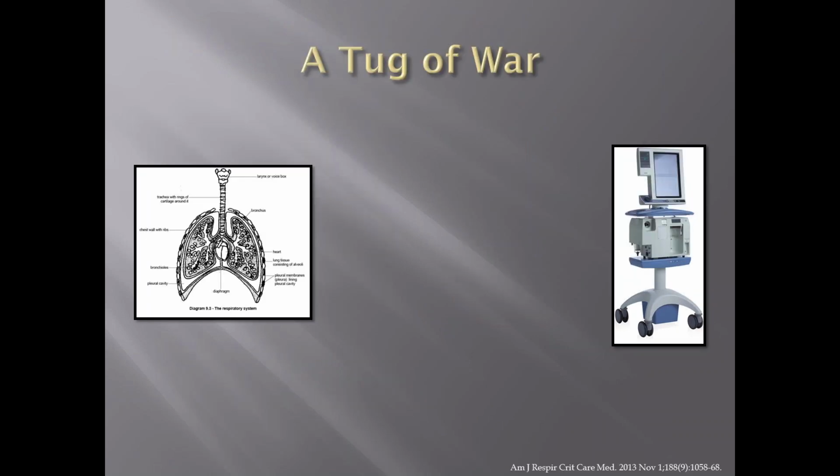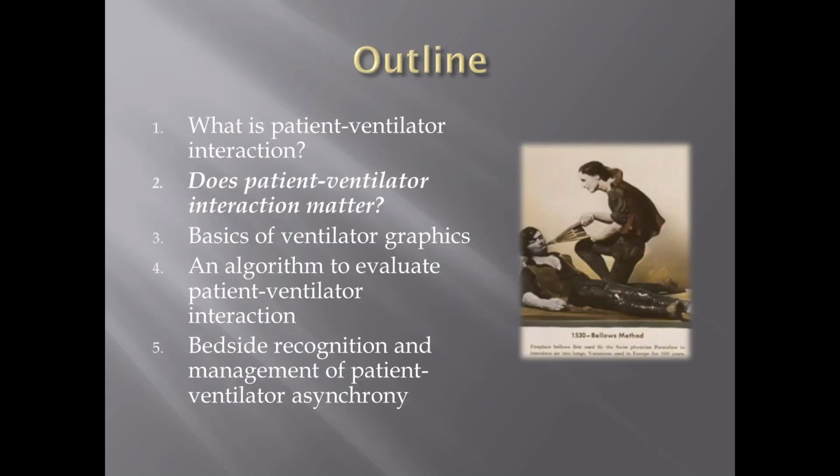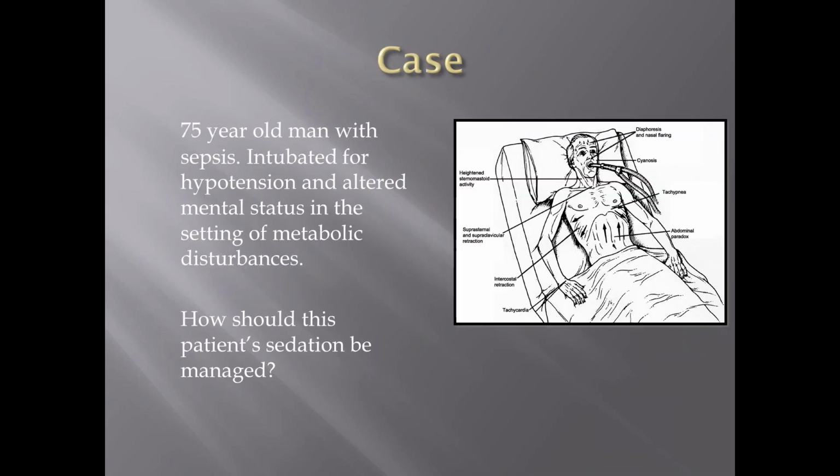When the patient and the ventilator are not synchronous, it's sometimes said to be a tug of war, and you're actually defeating the purpose of why you intubated them in the first place. All right, so does this matter?